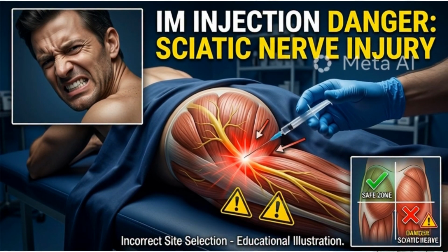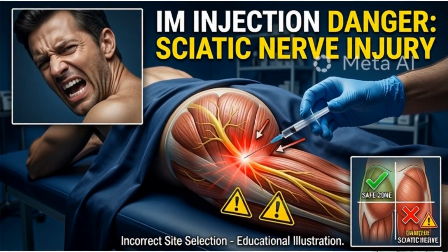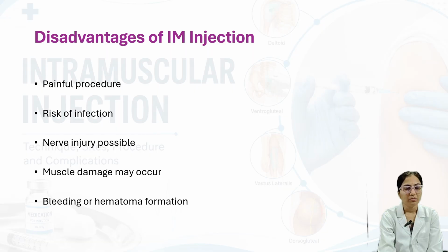Next, we'll see the disadvantages of IM injection. It is a painful procedure, there is risk of infection, nerve injury is possible, muscle damage may occur, and bleeding or hematoma formation. These are the disadvantages of intramuscular injection.